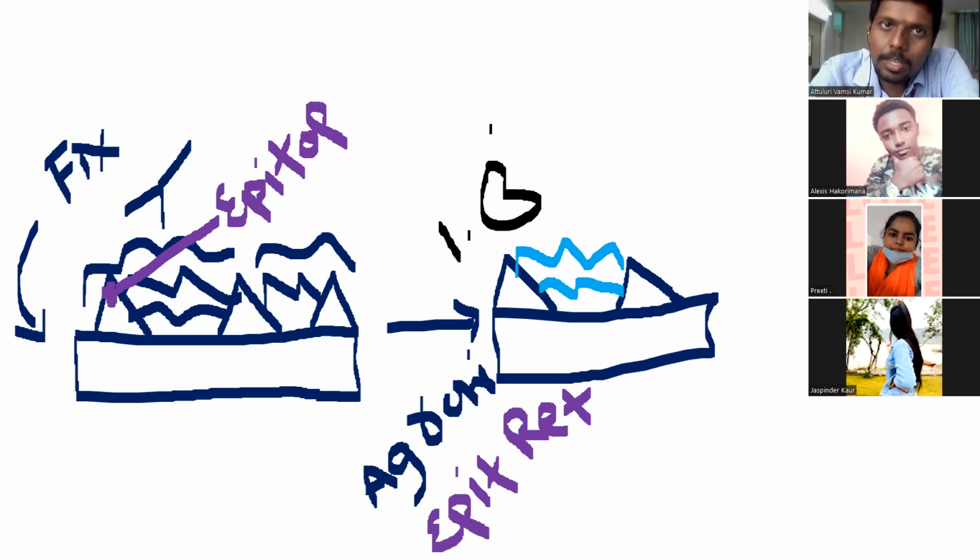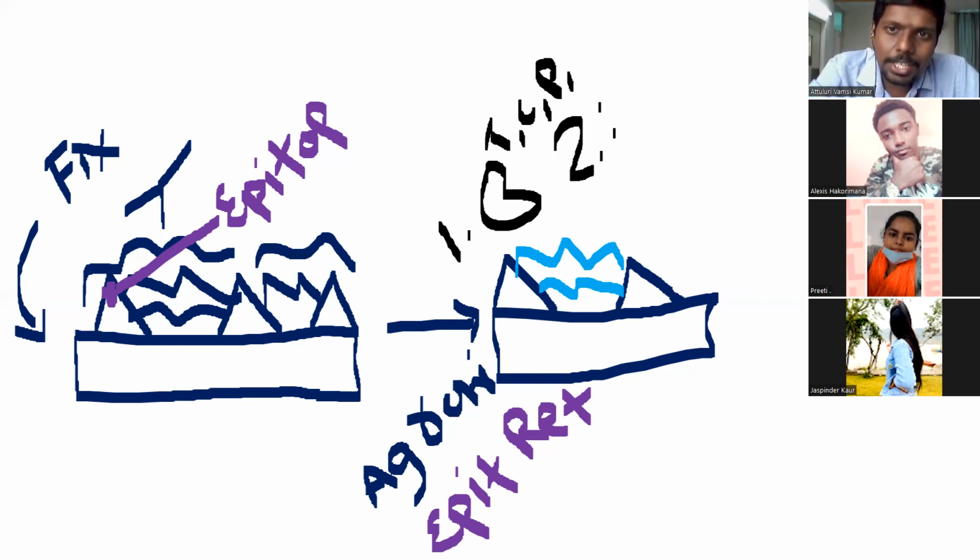Enzymes like proteases, the enzymes that cleave proteins or the crosslinks. Here the crosslinks are formed due to polypeptides, which is due to collagen crosslinks, so enzymes can be used to remove those collagens. Proteases, such as trypsin, chymotrypsin, and all enzymes that can cleave proteins, can be used to remove these crosslinks. Or we can also use a second technique, which is the heating technique.